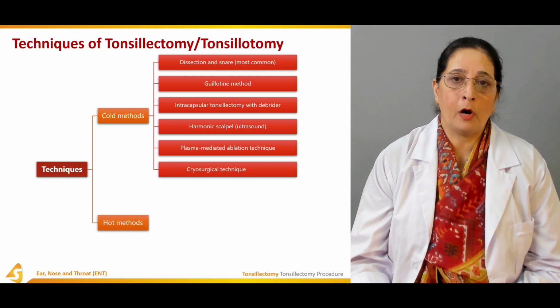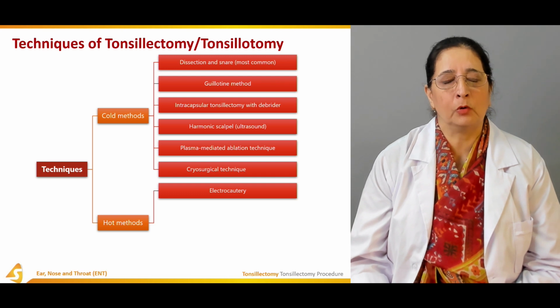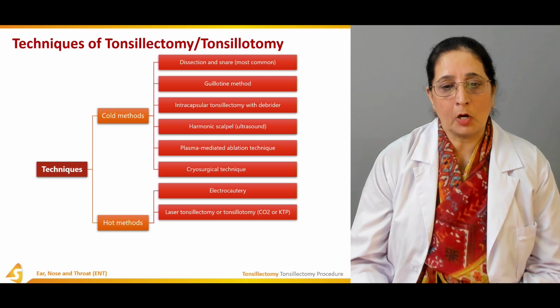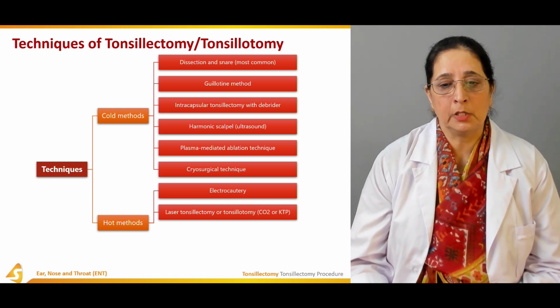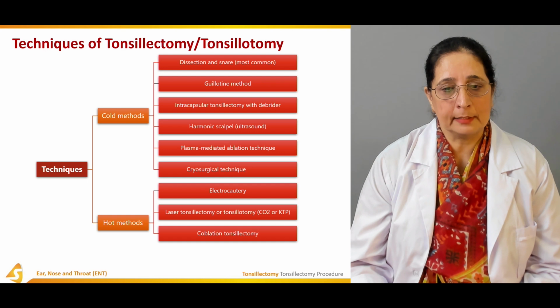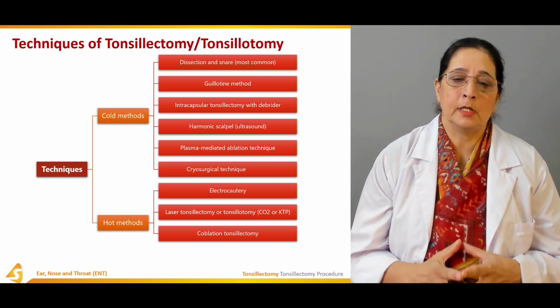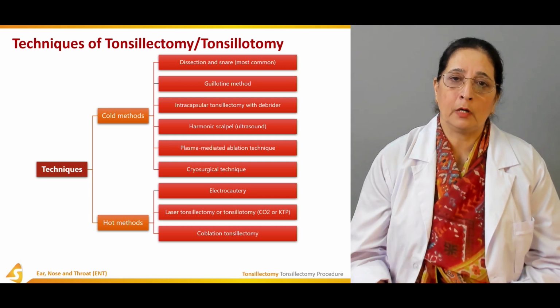Then we have some hot methods of tonsillectomy also. Electrocautery, that's a hot method. Laser tonsillectomy or tonsillotomy, in which we use carbon dioxide or KTP laser. Coblation tonsillectomy. So all these are the different methods of tonsillectomy, which can be cold methods or hot methods.